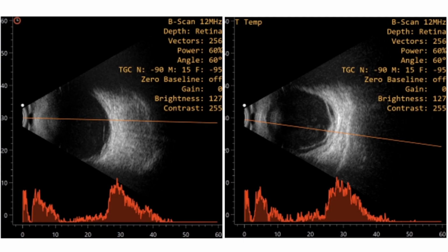So the ultrasound was done. The vitreous cavity is having low reflective dot echoes. We could see a retinochoroidal elevation. The right side scan is showing a retinochoroidal elevation with variable reflective membranous echoes on either side of the lesion, and the overlying vitreous is also showing some low reflective dot echoes. Okay, so we'll come to this later.